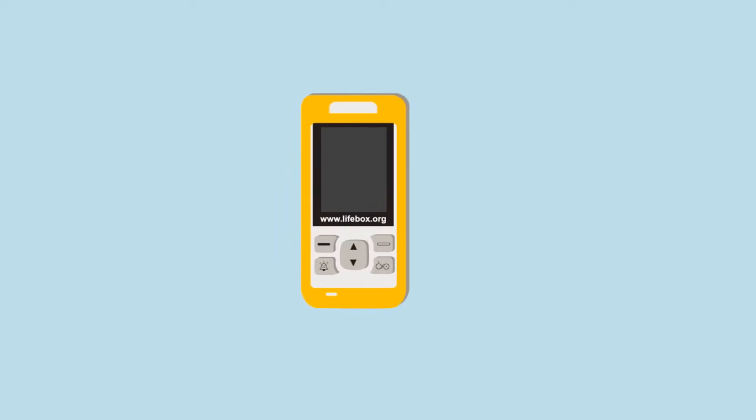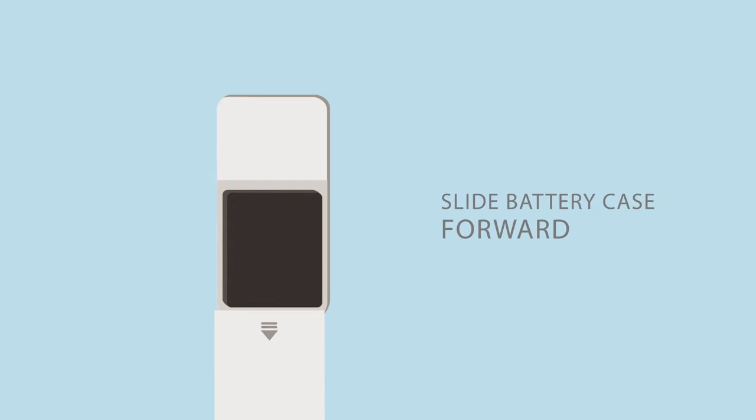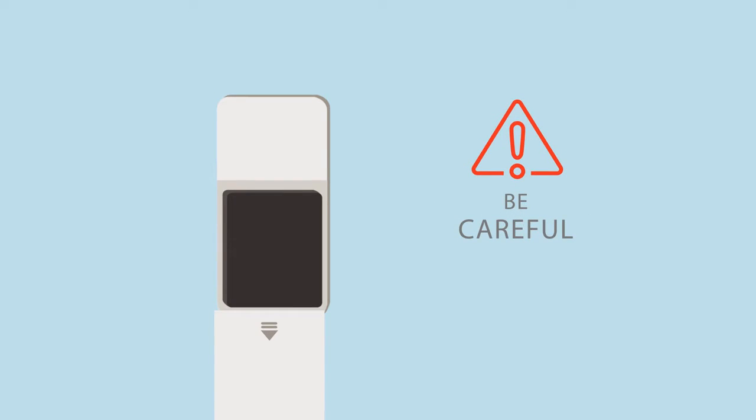To install the battery, first you need to open the battery case. Turn the oximeter so that the screen is facing downwards and peel back the yellow cover until you can see the raised arrow. Rest the oximeter screen side down on a flat surface. Place your thumbs on the raised arrow, press down firmly and slide the battery case forward. Be careful not to press your fingers on the screen when you do this. Too much pressure and the screen might crack.